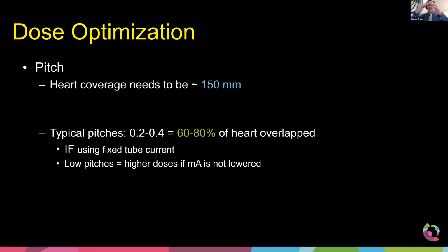And so if we just simply go straight down through it as fast as we can, we're not actually going to image the heart perfectly stationary. It's going to be compressing. It's going to be going from systolic to diastolic. So we actually go the opposite route. We go as slow as we can when we do helical imaging. We do very low pitch, 0.2 to 0.4.